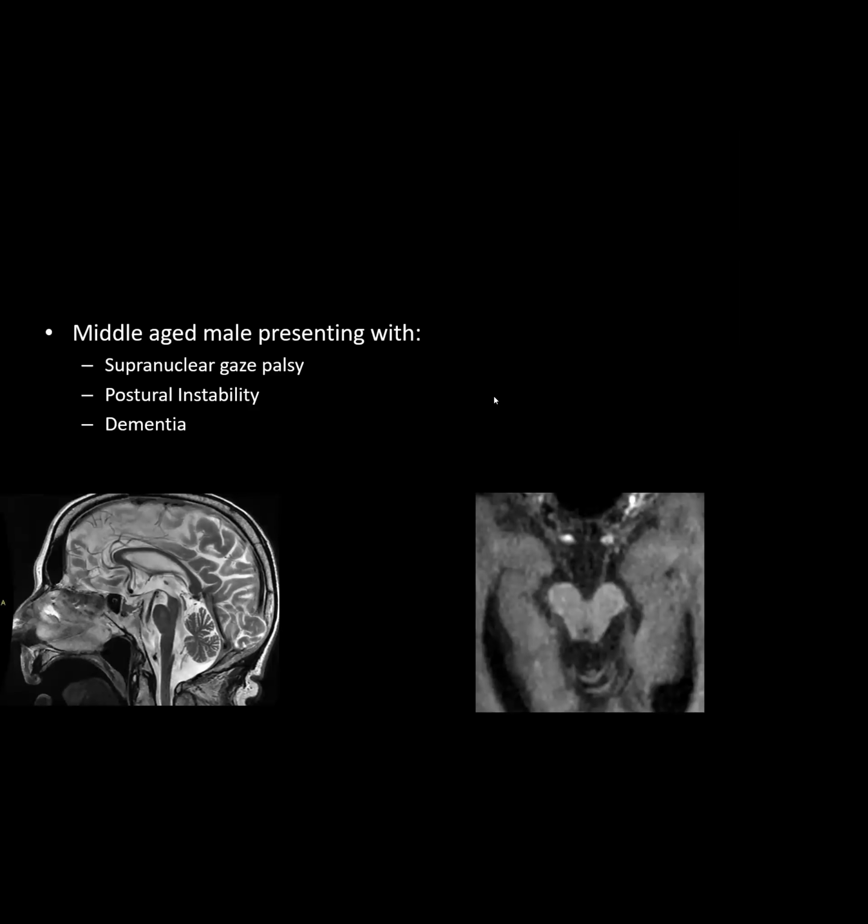Another person with a Parkinson plus syndrome. So supranuclear gaze palsy, postural instability, and dementia. Dr. Len, what do you think this is? Progressive supranuclear palsy.